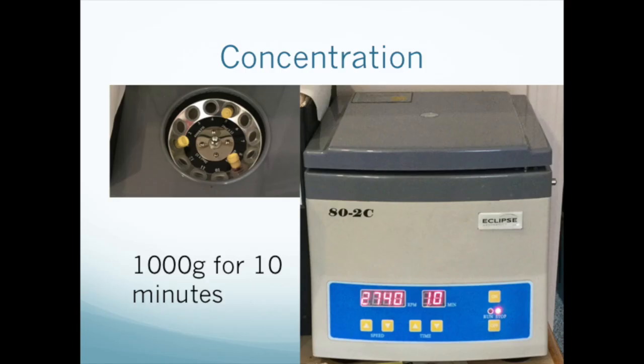To concentrate your PRP, place the tubes of plasma into the centrifuge equidistantly. Add a ballast tube if necessary. Spin at 1,000 g's for 10 minutes. You'll have to do the RPM to RCF calculations again, since this time we're using a different speed and we are targeting the bottom of the test tube. When you remove the tubes, you should see a small pellet in the bottom of each one — that's your platelets.